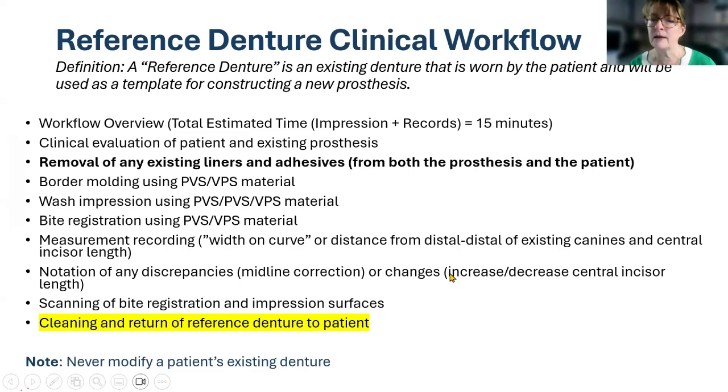The thing that I really like about it also is that at the end, you're peeling out that impression material and giving your patient back their teeth, right? So they're never without their denture. And that is quite a big deal for many patients.